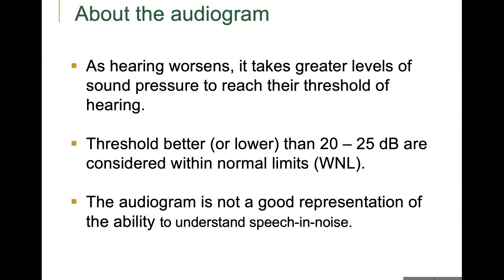While we do perform pure tone audiometry from 250 to 8,000 hertz, sometimes beyond, to give us an idea of how well a person is hearing, the status of their hearing, the audiogram, the pure tone thresholds aren't necessarily a good representation of the ability to understand speech in noise.